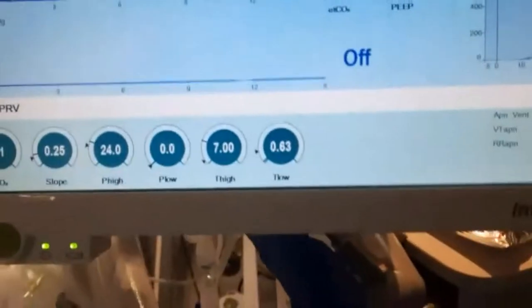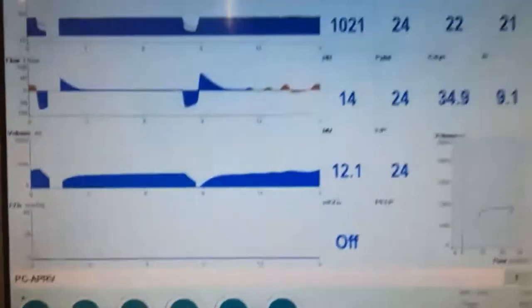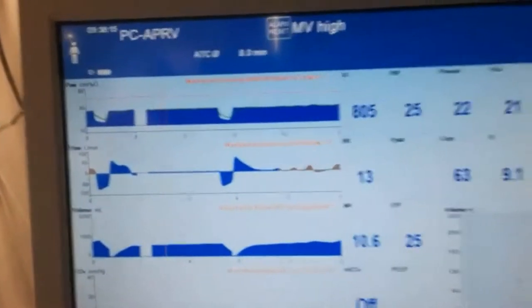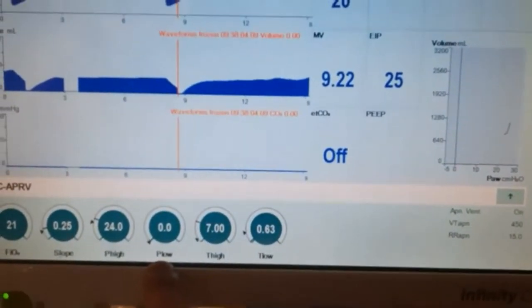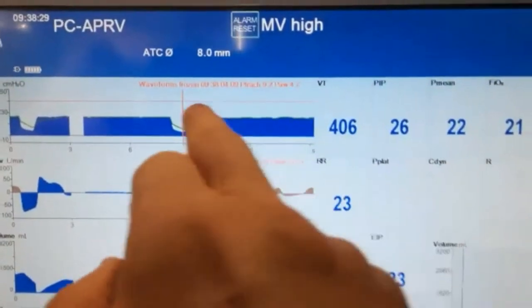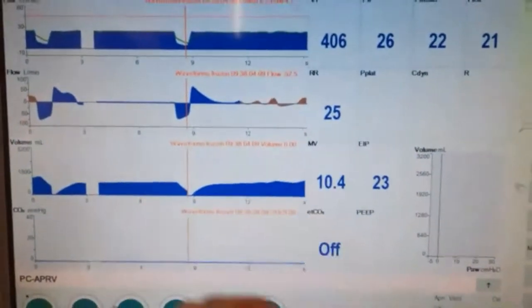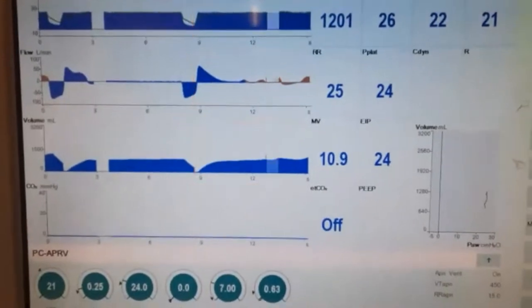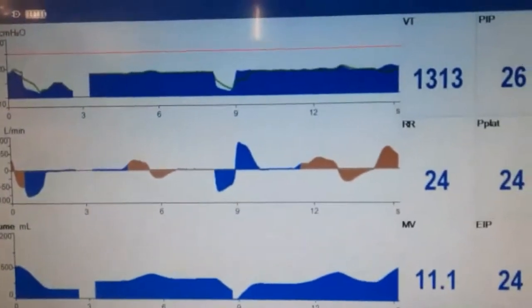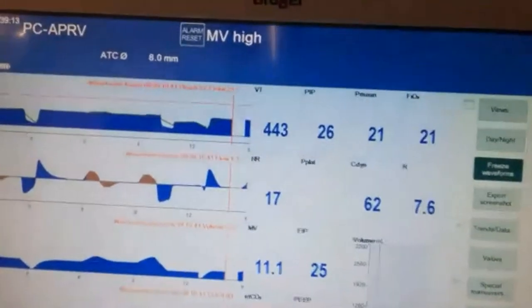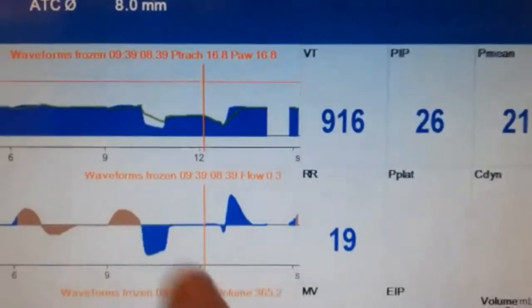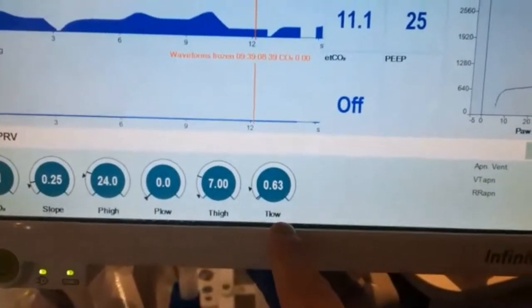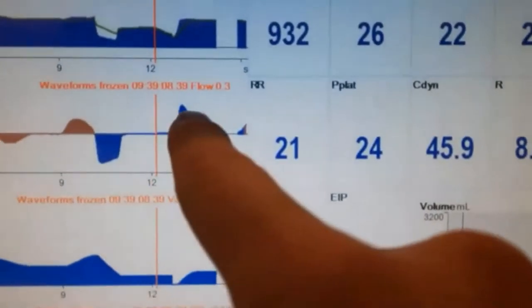Looking at the P-low: with P-low set at zero and a freeze-frame, the measured circuit pressure during release shows about 4.7 cmH2O — but this is circuit pressure, not lung pressure. To truly see the auto-trapped P-low inside the lung, perform an expiratory pause. When done, the pressure equilibrates — here it shows 16.8 cmH2O. By creating a very brief T-low targeting 75% of peak expiratory flow, we purposely cause air trapping. You can see the flow doesn't reach baseline; it starts descending then returns right back up.